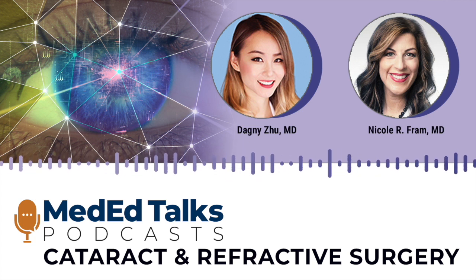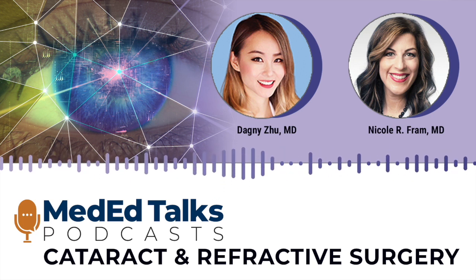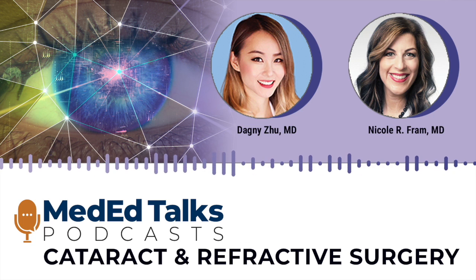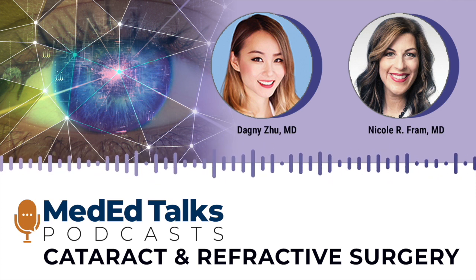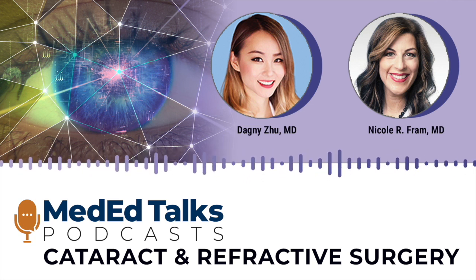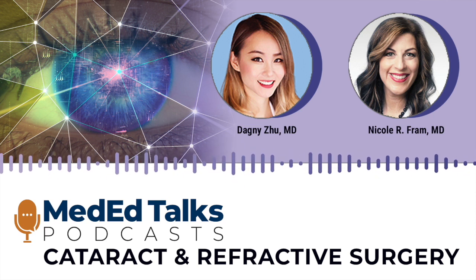And then you can use certain different platforms on femtosecond lasers that actually put capsule tabs in the actual capsulotomy, and you can line your toric up with that. And that's image guidance also from either an IOLMaster 700 or a Pentacam or Cassini and things like that. So it's a really exciting time because we can actually make sure intraoperatively that we're on the steep axis. When you look at rotations and issues with residual astigmatism, a majority of it is improper placement at the time of surgery. And we keep saying it's rotating, but we probably put it in the wrong place.